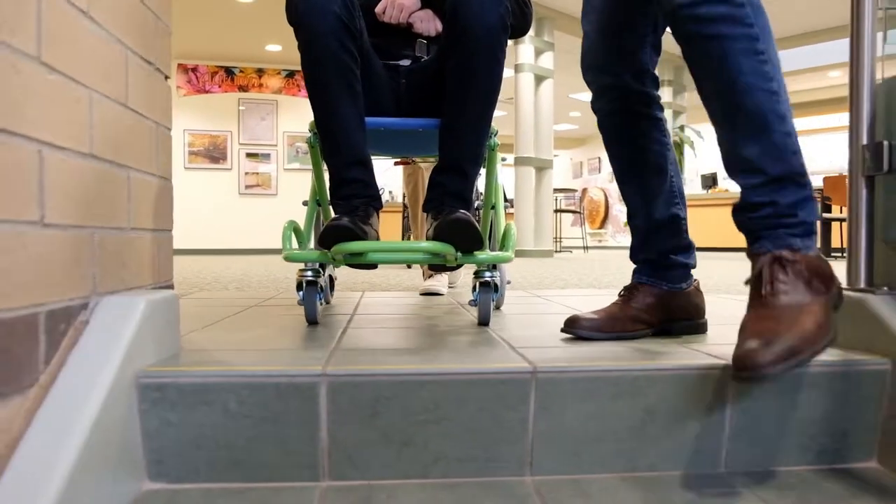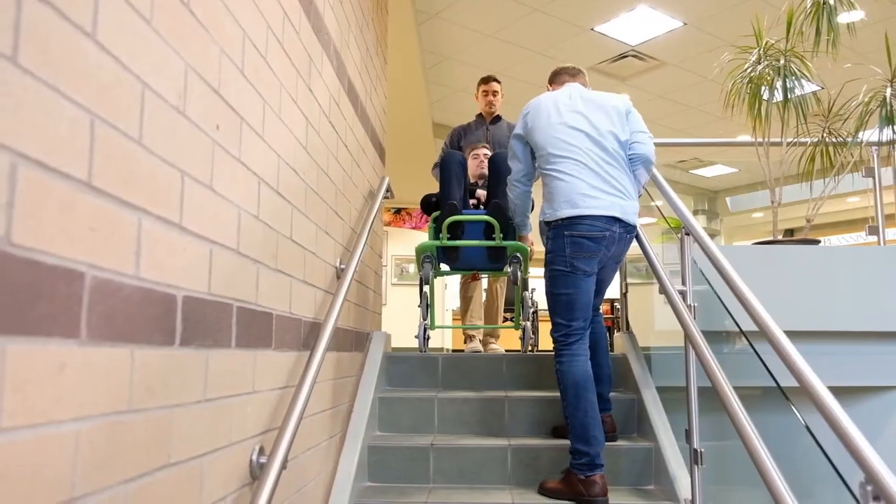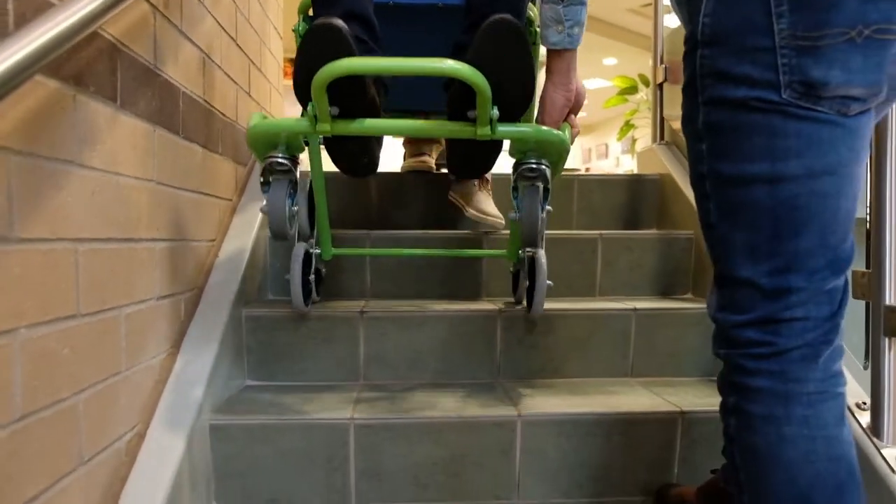Once at the stairs, one person should hold the handle at the rear of the chair and one or two people should hold the lifting handles at the bottom of the chair. Maneuver the chair slowly and confidently down the stairs.